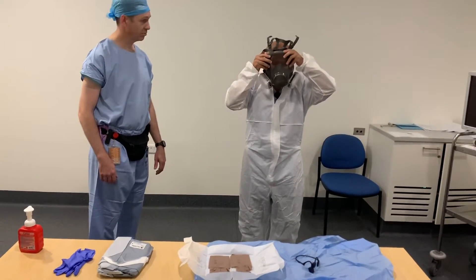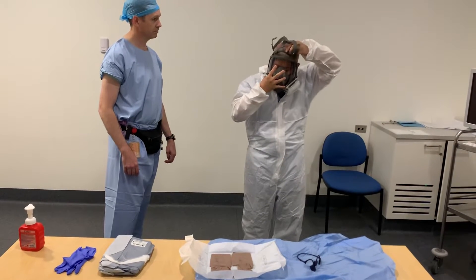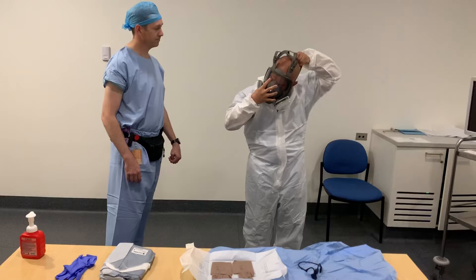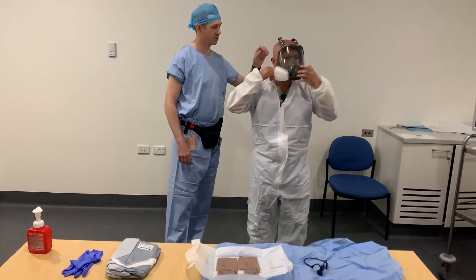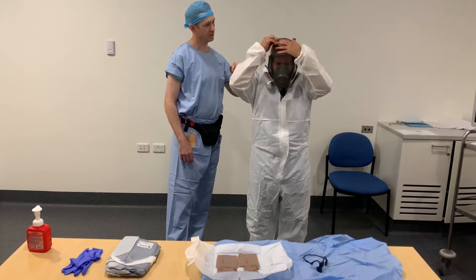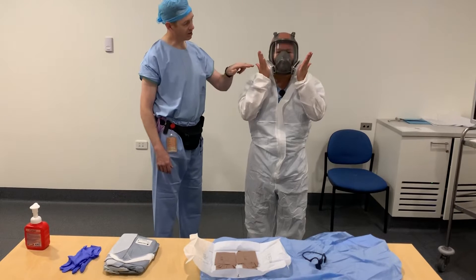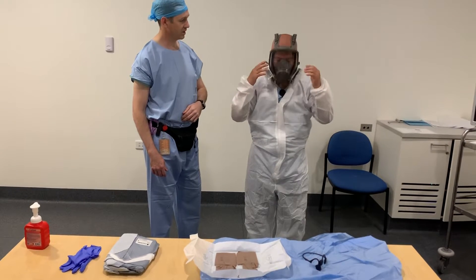Place it on your face first, pull the straps over to the back of the head. Have your buddy check to tighten the straps — lower straps first, then tighten the upper straps. Place your palms over the aperture and inhale to test the fit. That's a good fitting mask.